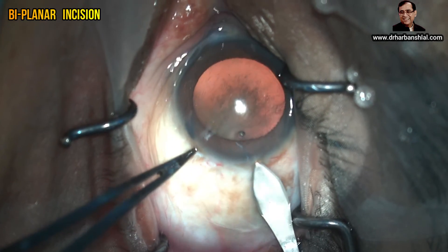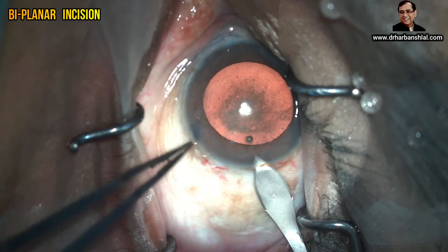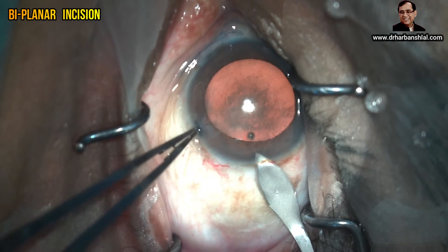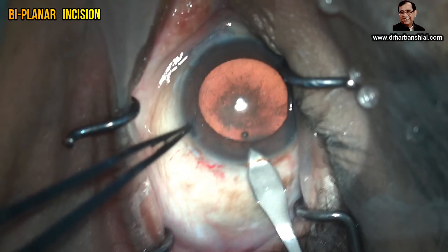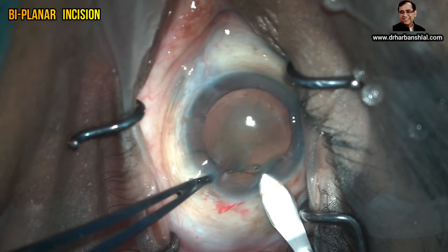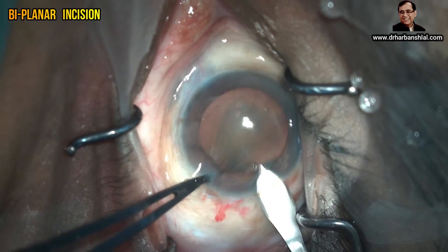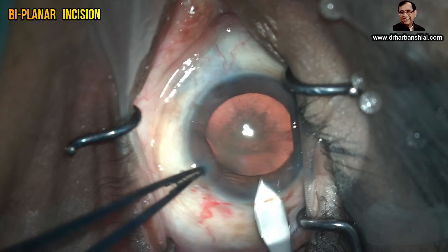Stabilize by grasping the side port incision. Once the keratotome is initially engaged, the tip is pointed according to the curvature of the cornea — that is, slightly forward. Once you have reached 1.5 to 2 millimeters deep, then point the tip backwards to achieve the perforation, and again forwards to achieve the perfect tunnel.